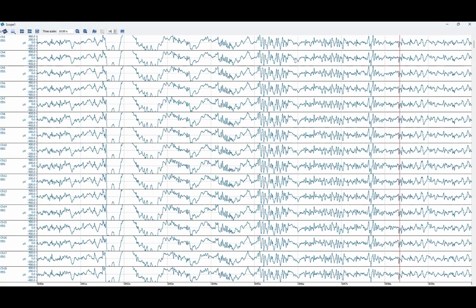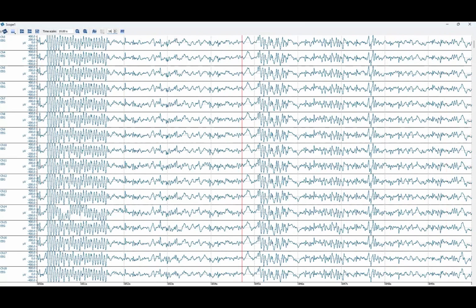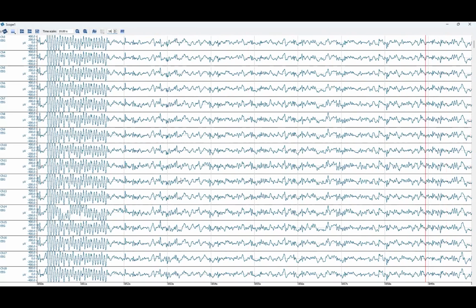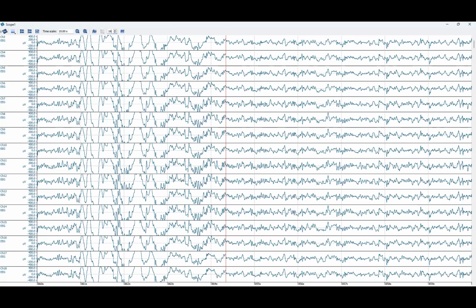And here you can also see that the lifted channel 16 is nicely visible because the sticky electrode gel still has some contact. And the washer is also making sure that we don't get shortcuts between the electrodes, which is of course super important.